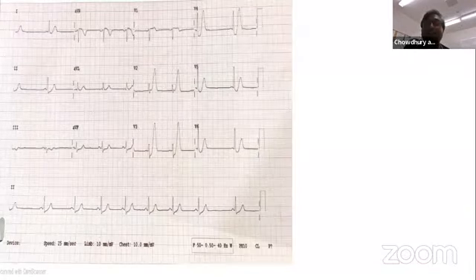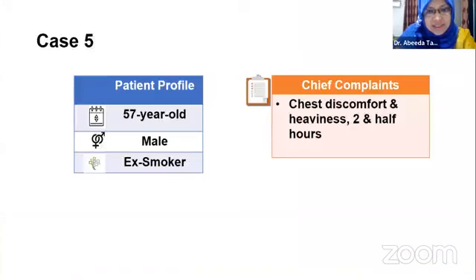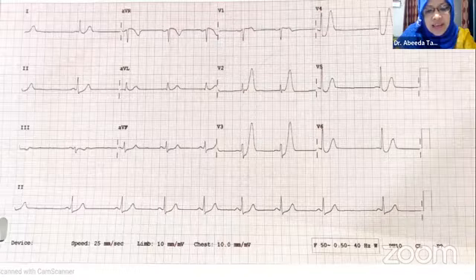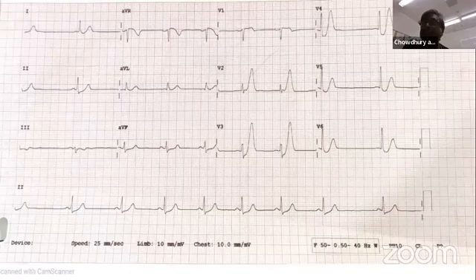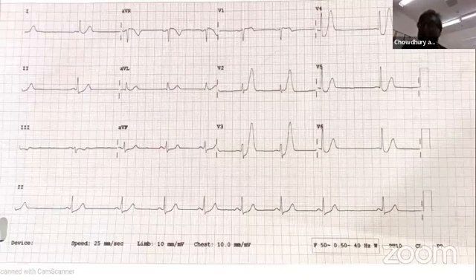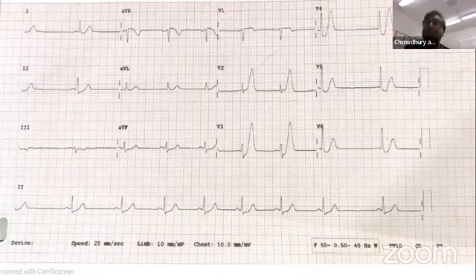Is this a dialysis patient? No, sir. He was actually just a smoker. He did not have any risk factor. I'm saying that clinical context is important. If this is a 50-year-old dialysis patient coming with fatigue, hyperkalemia, okay, I buy it. But if it is a 45-year-old smoker coming with chest pain 10 out of 10, then, you know, it's raining, you go out, you get wet.